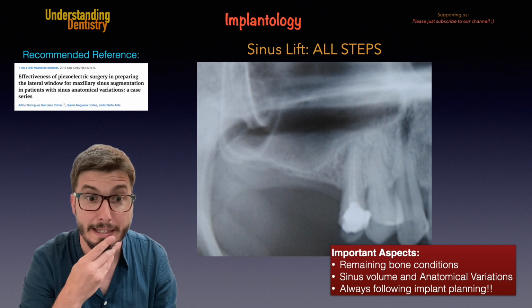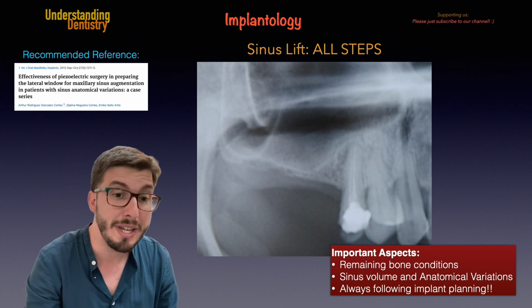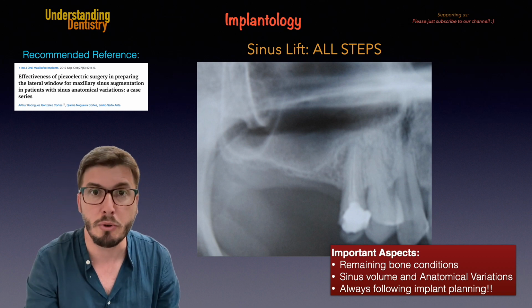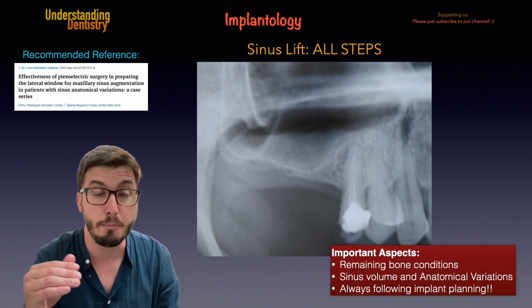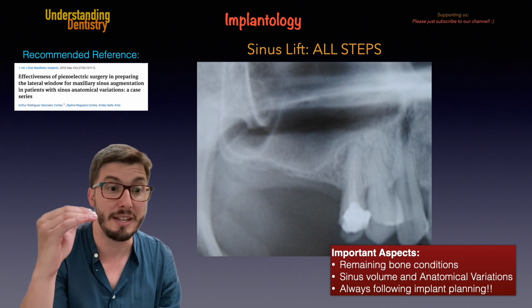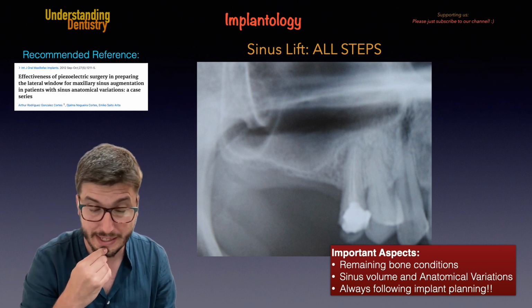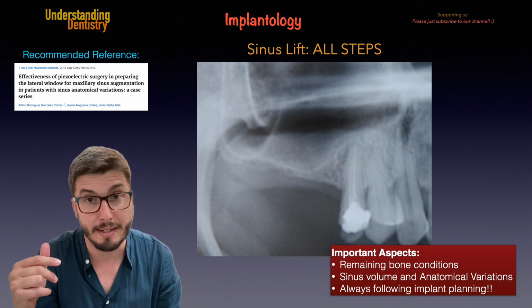But here in this case, we are seeing two different alterations. We are seeing horizontal bone loss, so there is bone loss at the level of the alveolar crest. Take a look at the teeth. The level of the bone is in the middle of the teeth now, right? So it's in the middle third of the roots. Of course, there is still no mobility, but we lost some bone.